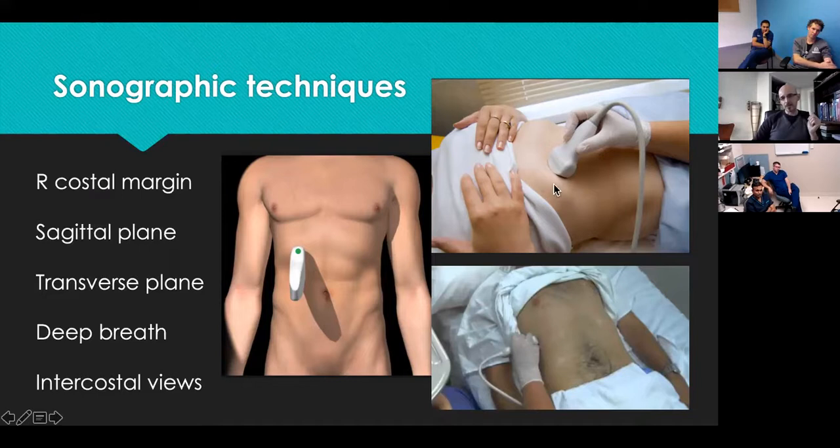A lot of times, if the patient is supine, which would be the position for most ICU patients, I assume, the biliary system is completely behind the ribs and you won't be able to see it most often. If the patient is not intubated, then you can ask the patient to take a deep breath in and hold. That can help. Otherwise, if we can put the patient in the left lateral position, that can help bring the biliary system off the rib cage, and that can help visualizing the biliary system.